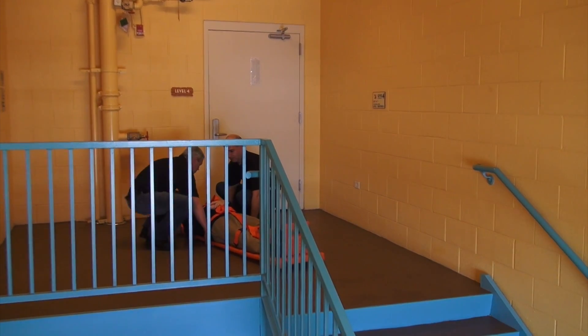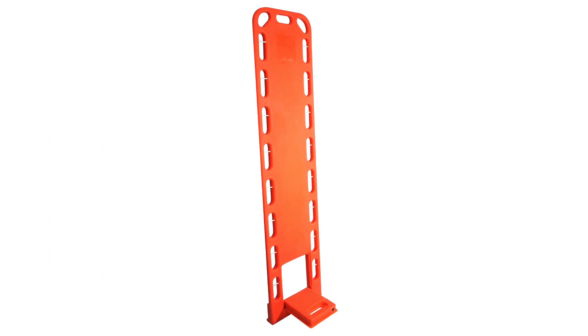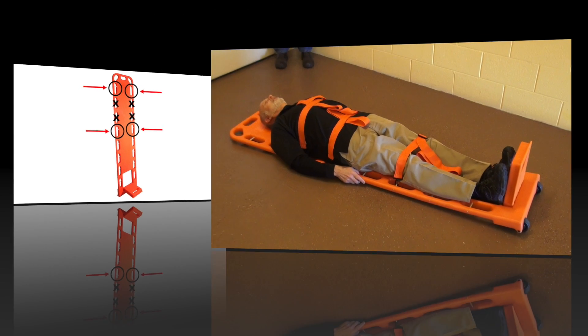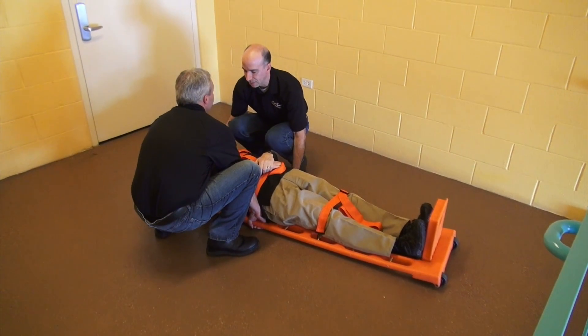Two paramedics can lift a patient by facing each other on either side of the patient's head. With one hand, grip the first opening below the corner. Skip two openings, then use your other hand to grip the next opening. This wide span between your hands will create stability. Face each other and lift with your legs, not your back, keeping your head up and back straight.